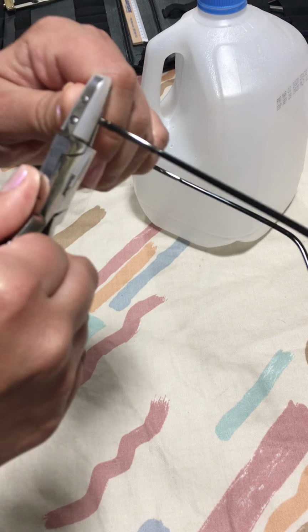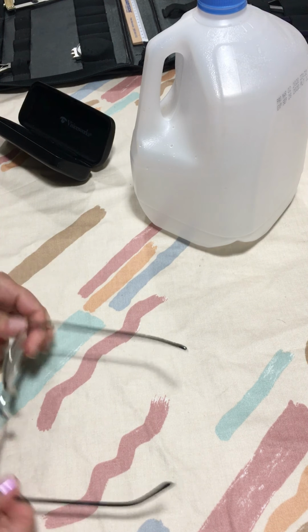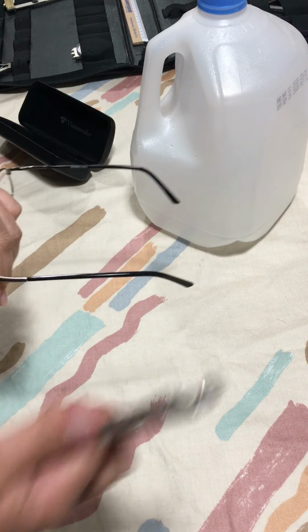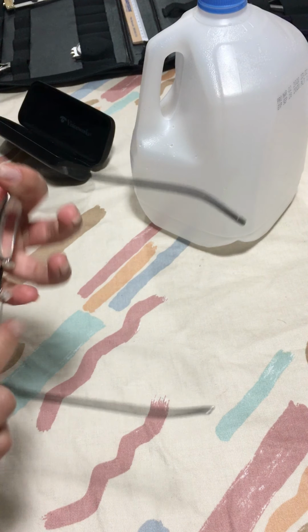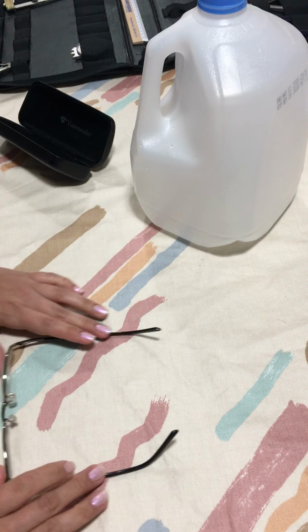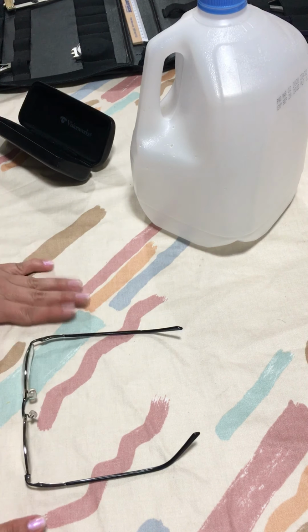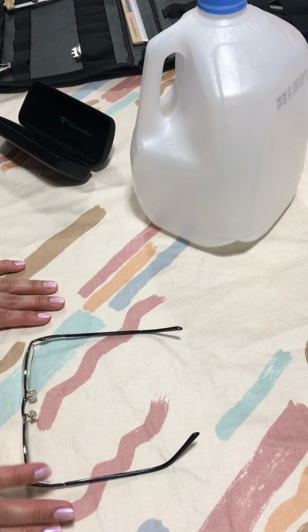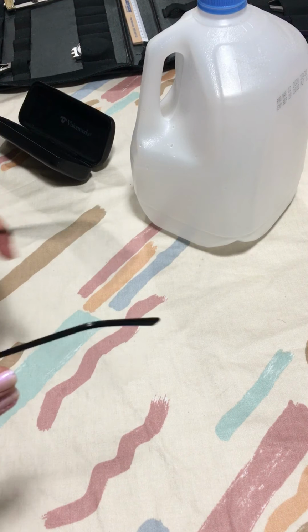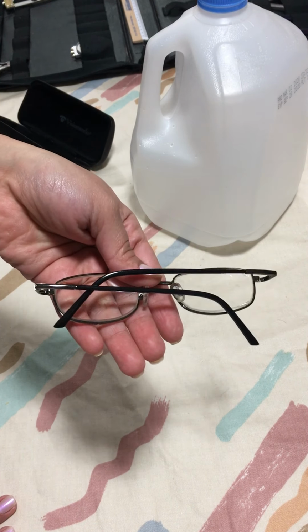Doing a little bit of temple spread. Okay, it still has a little bit of temple parallelism, so I'm using my wide angling plier in order to raise that up a little bit. Okay, now it's better, it's good. Okay, I'm looking at the bridge to see if it has any misalignments on the bridge. Everything is good on the bridge. I close it, and I have this.